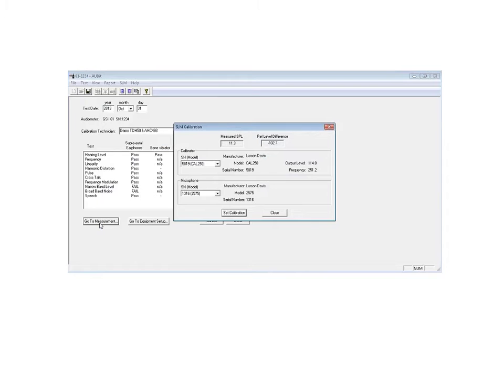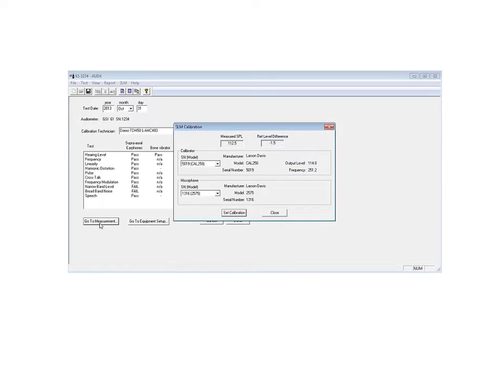The first thing it wants us to do is check the calibration. So I'm actually putting that black CAL-250 calibrator over the microphone, and we're watching the measured sound pressure level coming in the window.